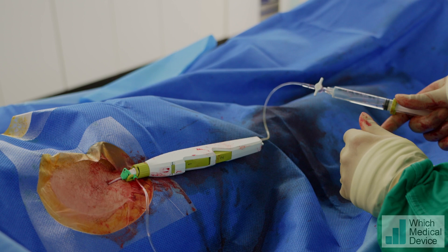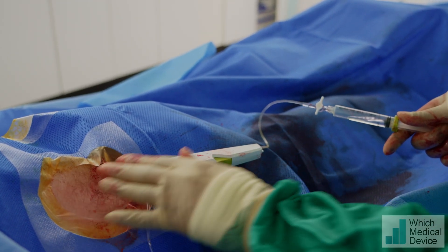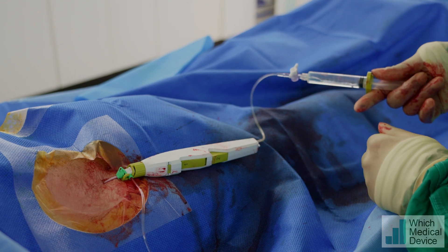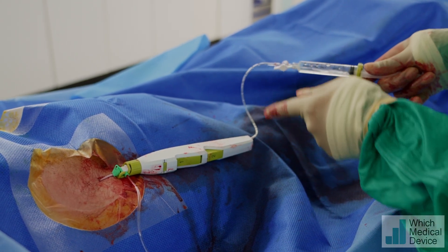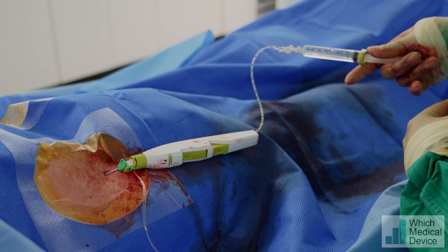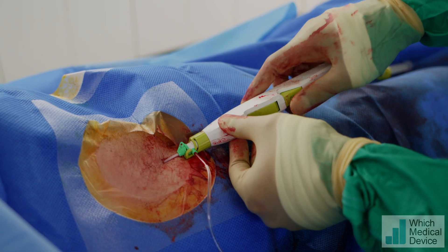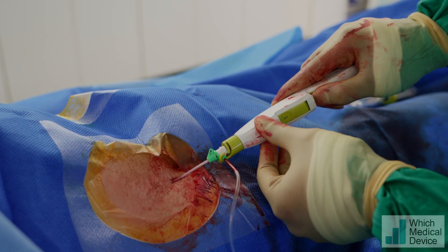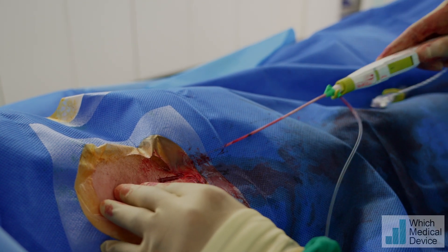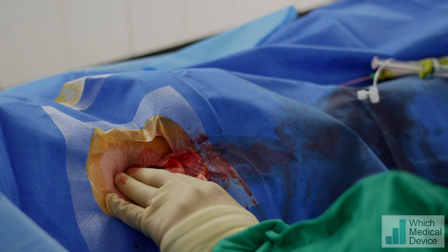Two minutes has now lapsed and we're fairly happy with how the groin is looking. At the moment we've got the balloon on suction so it's still inflated. I'm going to turn this on and hopefully you'll see air coming in. At this point the balloon is deflated. So all we need to do now is press number two to capture the device, and then press for a little bit for completion of hemostasis.